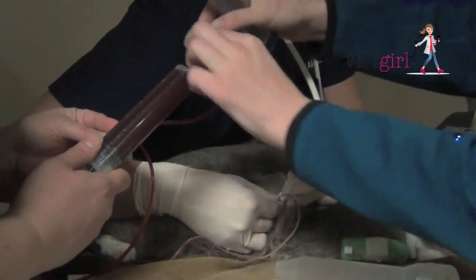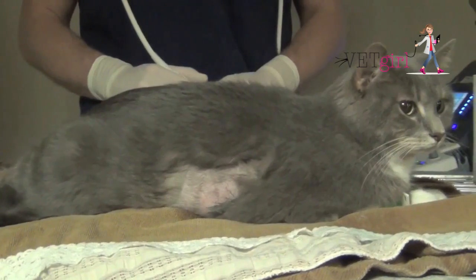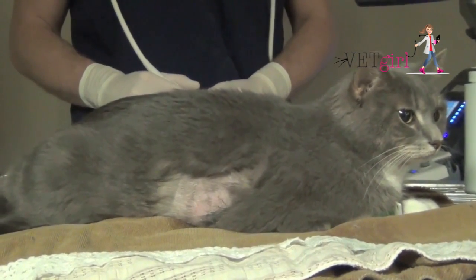Clinically, you can see that this cat is dramatically improved. It's breathing much more comfortably and is no longer breathing with a short, shallow breathing pattern. With that, hopefully you feel comfortable performing a thoracocentesis.